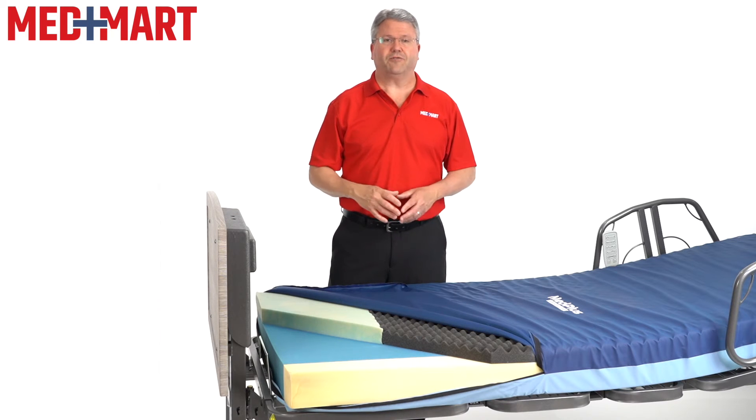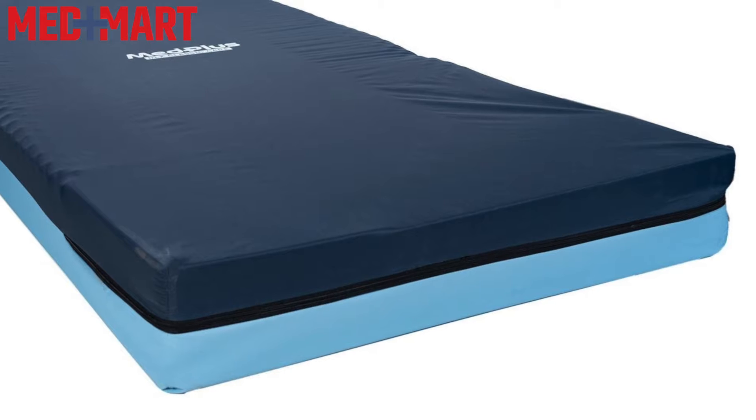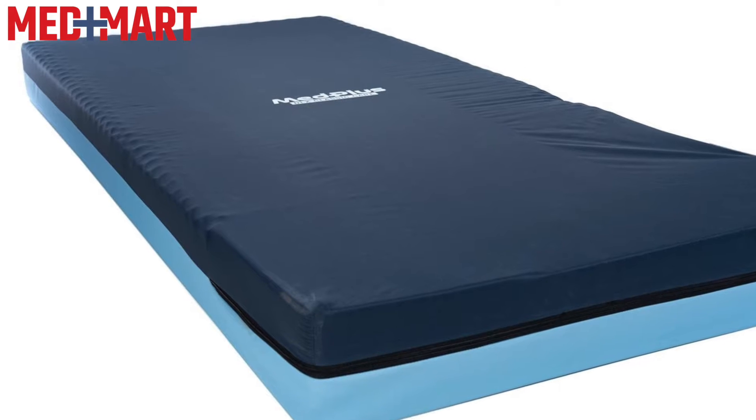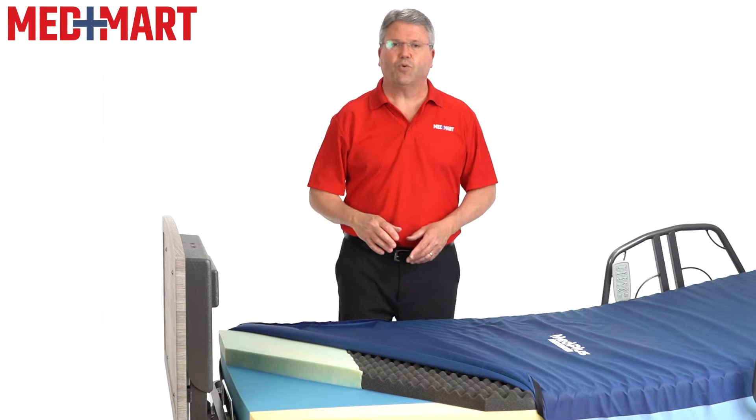Are you looking for a comfortable home care mattress with additional heel protection and an incredible value? The HeelCare RLX by MedPlus at MedMart offers amazing support at an unbeatable price. My name is Jeff, and I'm a product expert here at MedMart. I've been a registered nurse for over 25 years.